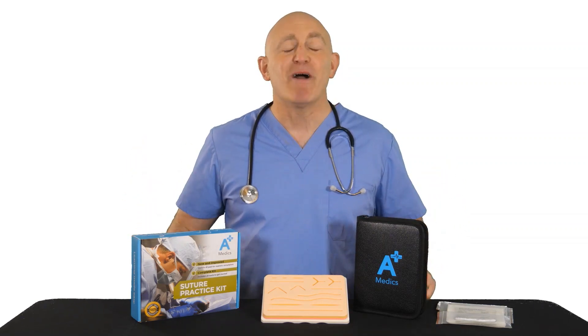So, what are you waiting for? Master the art of suturing using the most durable suture kit on the market today.